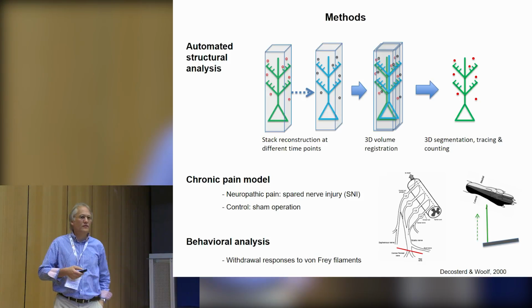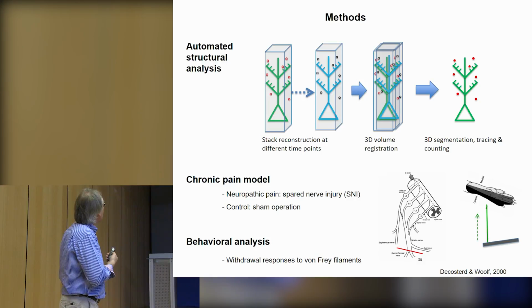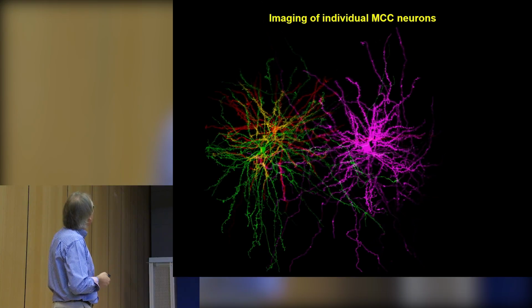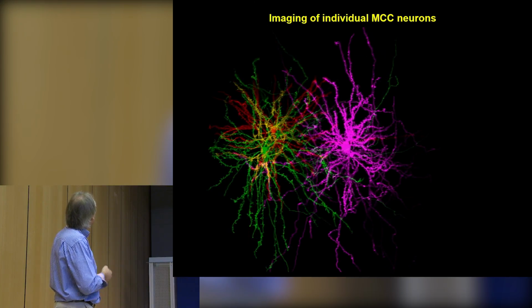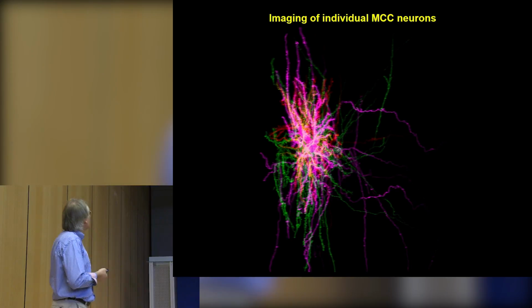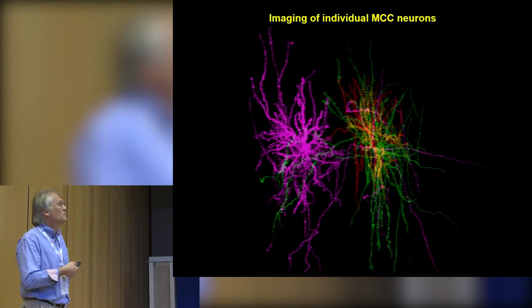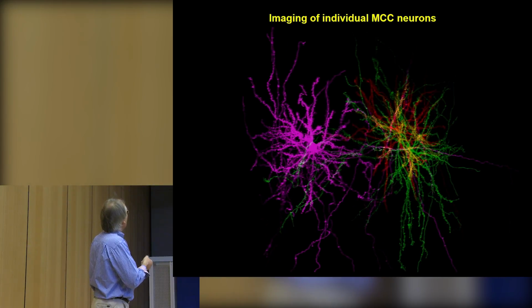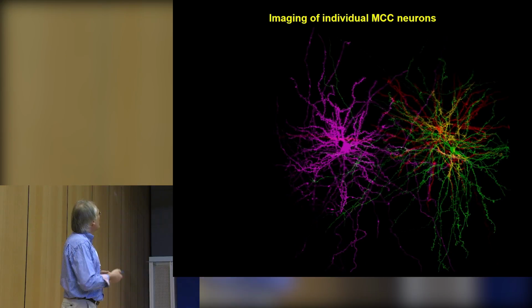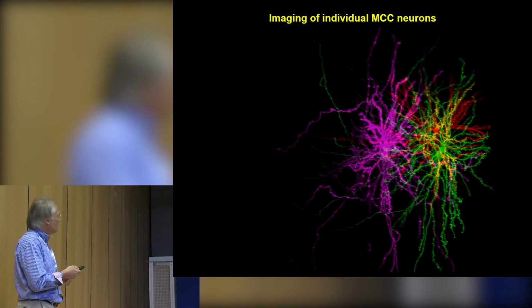So this is an example where we have now 3 neurons in our imaging volume. They are still reasonably separate from each other so that they can be analyzed. You can also see that they actually differ in their morphology quite a bit. So this one is much more spiny than the green one, for example. And we can, of course, try to do morphological categorization of these neurons and relate the overall morphology to changes in spine plasticity. And of course, we also do post hoc analyses. So we find these neurons again after sacrificing the mice and do immunohistochemistry so that we can identify what kind of cell types these are. So this is the data that needs to be analyzed.